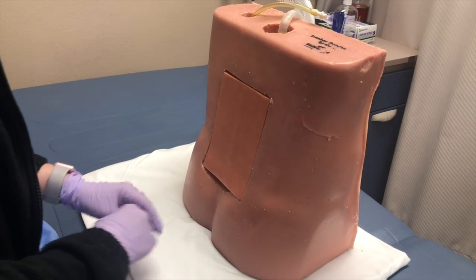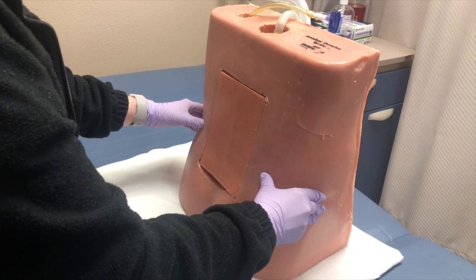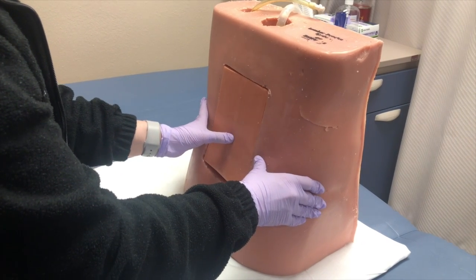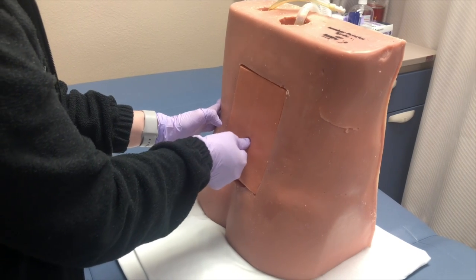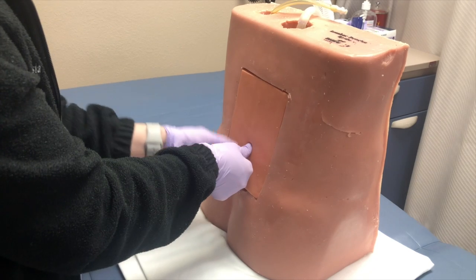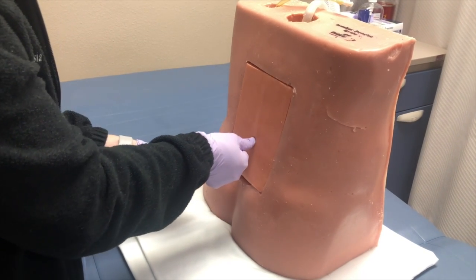Locate anatomic landmarks by first identifying the tops of the iliac crest. This should be around L4, which is also known as Tuffier's line. The midline is identified by palpating the spinous processes. The soft space between the spinous processes is the interspace. Either L3 to L4 or L4 to L5 can be used to introduce the spinal needle.